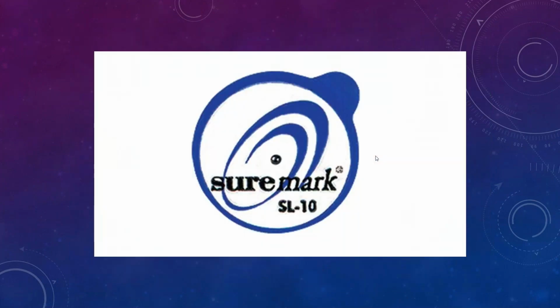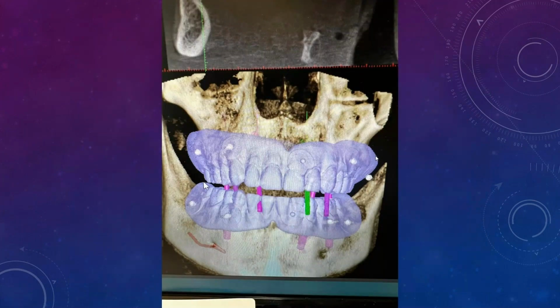So when you've done it like this, when you've marked it and you scanned everything in, a lot of people will just use this and convert that file. So the secondary scan of the dentures, they'll convert that file into an STL and use that for the surgical guide. Some people think that you can just do the secondary scan without doing the secondary CT. So when you do your initial CT scan of the patient with dentures in, the second one you do is of just the dentures themselves. So you usually have three scans: one like this, one of the maxilla, one of the mandible.